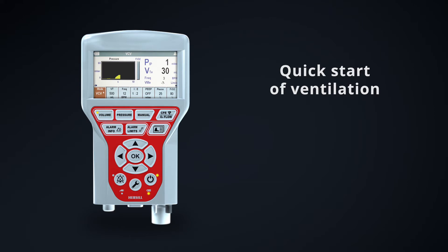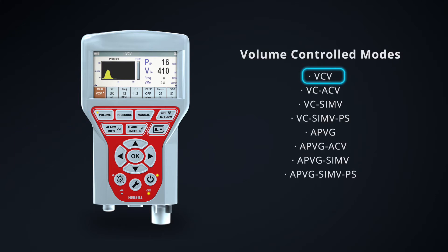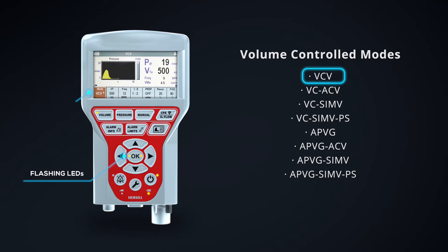The ventilator will enter the preset ventilator mode, which in this case is a volume controlled mode called volume controlled ventilation. The red background and the flashing lights on a key mean that the setting requires confirmation by pressing the key. Only then it starts to run.